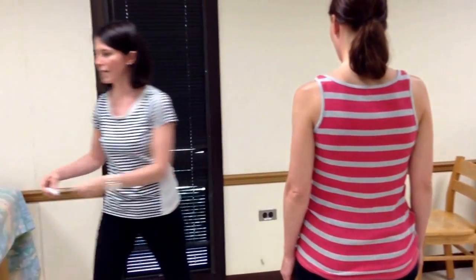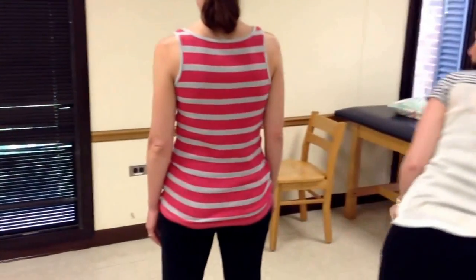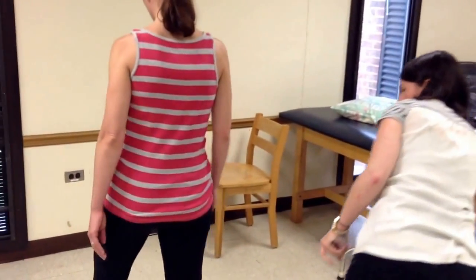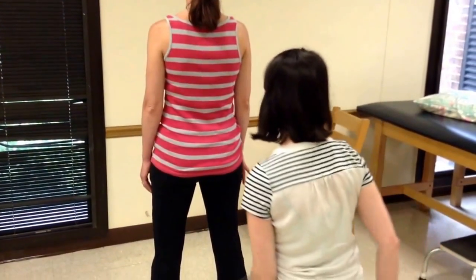Now I'm going to do trunk side bending using a goniometer. The patient remains standing — no shoes, feet shoulder width apart.